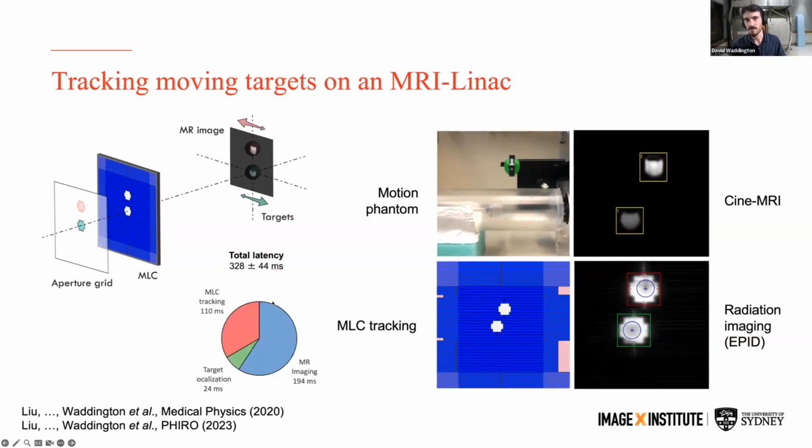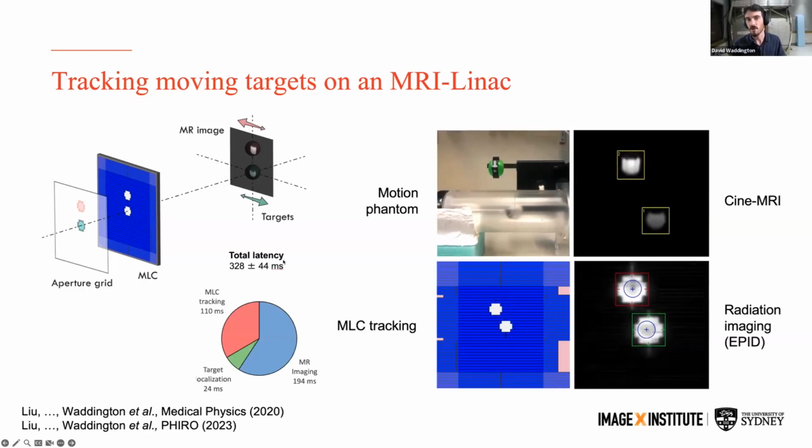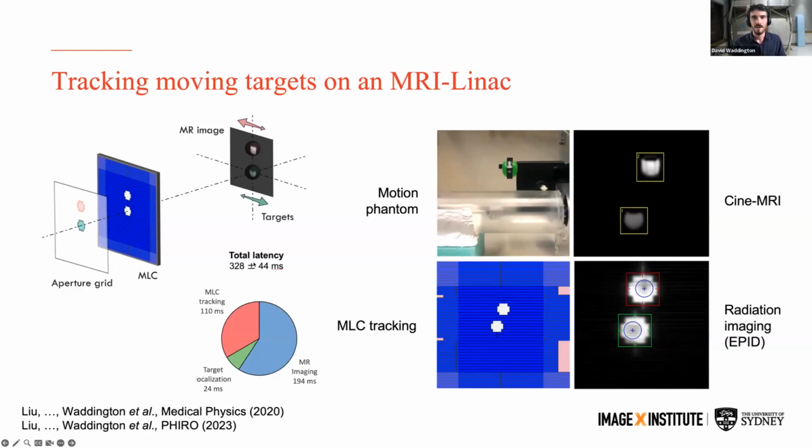We performed this with a simple experiment. We can see over here that we're getting about 330 milliseconds end-to-end latency.